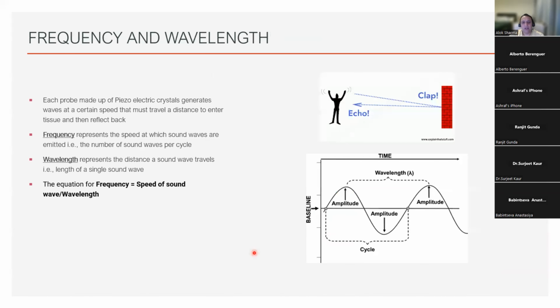So when you look at ultrasound, you're interpreting tissue, you're interpreting anatomy, but in the lung in particular, because there's an air interface, predominantly artifact is visible. We have now generated patterns with the artifact to recognize normal, abnormal, and various pathological states, which is related to the air and water content of the lung.